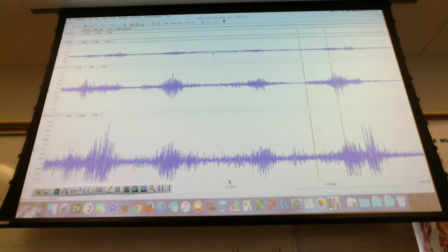Then what I want you to do for the next set of boxes, the extensions are kind of hard to find. I want you to find one good example of an extension and record for that one example what you measure on the anterior EMG and what you measure in the posterior EMG. And you can put that in the big box.